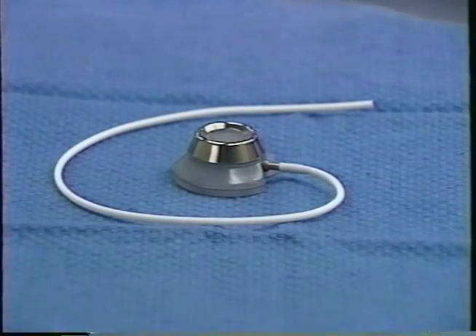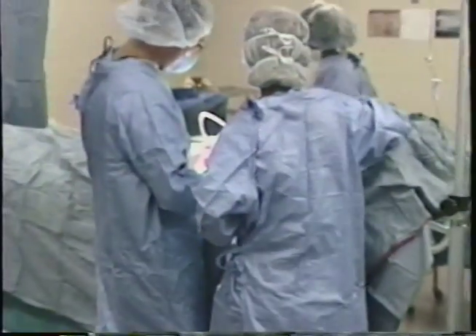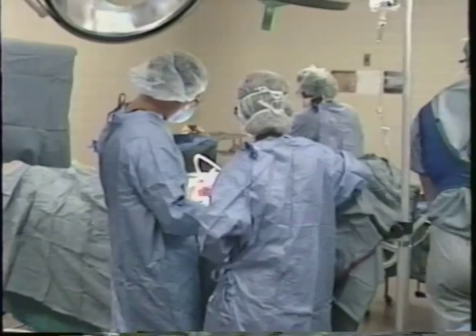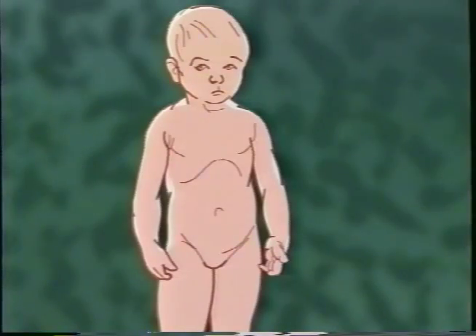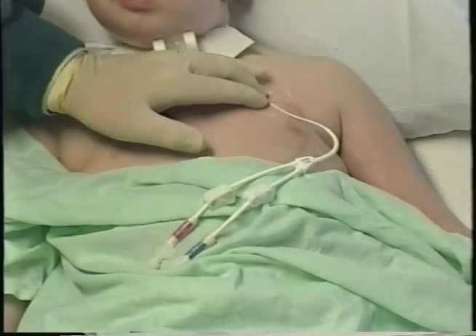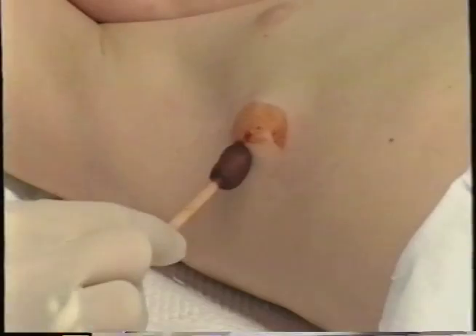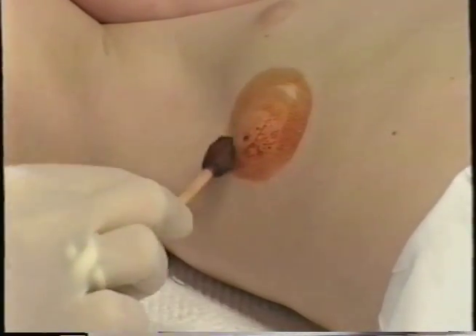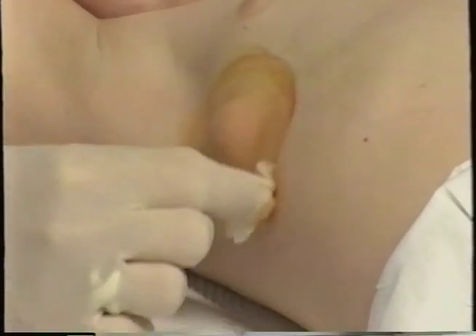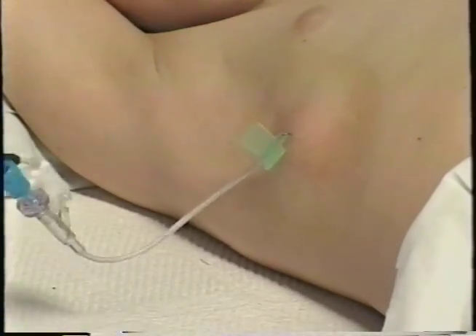Central venous catheters are placed in children to provide fluids, parenteral nutrition, medications, and blood products directly into a central vein. Long-term central venous catheters are placed in the chest, neck, arm, or groin and are tunneled under the skin from the entry site to the central vein. Some catheters are accessed at a site outside of the body. Others require a needle to access a port because the catheter is completely subcutaneous. In an emergency, blood samples can often be drawn through central venous catheters.